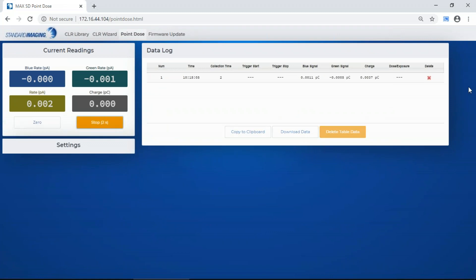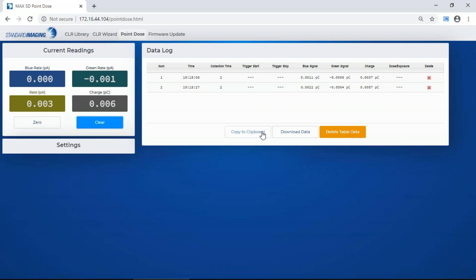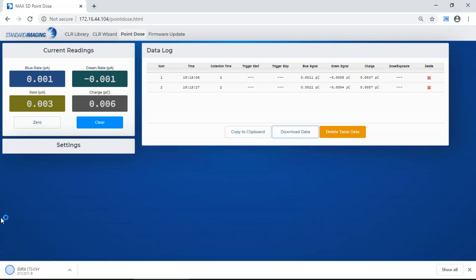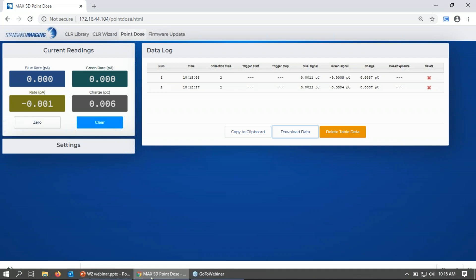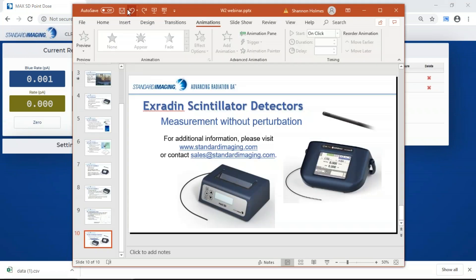After you've made several measurements, you can either copy the data to clipboard and paste it into Excel or your favorite spreadsheet program, or you can download the data as a CSV file to your downloads folder. That's what I had for the MaxSD — just to show you what that's like.